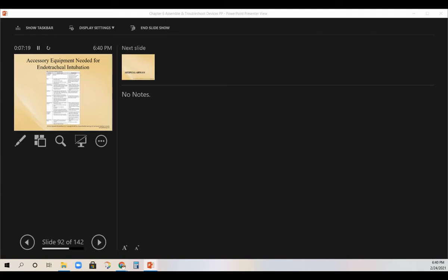Like it says, troubleshooting for intubation, not tube exchange. Then in parentheses, it says use a standard tube exchanger instead, because they know everybody uses it. Okay, so most people might not have one.